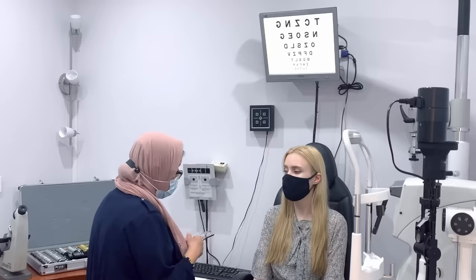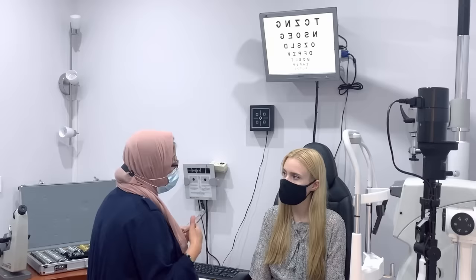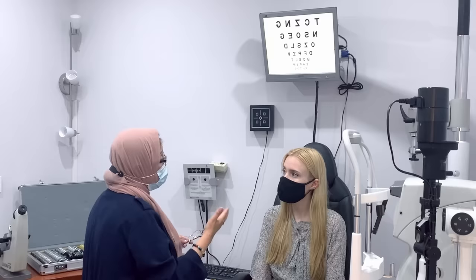Okay. But actually when you're using digital devices, there's a lot of advice on something called blue control, you know, having blue light controlled. Because digital devices let out a lot of blue light. And with these anti-glares, yes, it helps definitely. But the blue anti-glare effectively just calms the brightness of the screen down. So again, a lot of people appreciate a blue filter on top.